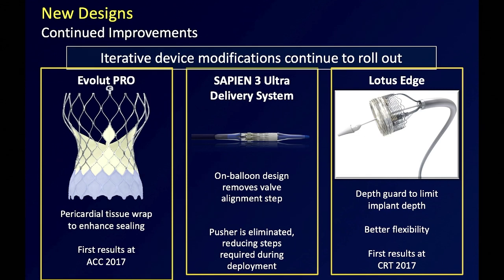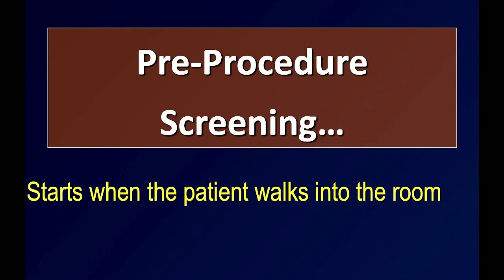The ones that we normally use in our lab are the balloon expandable valve approved in the United States, called the Sapien valve, which carries about 40% of market share in our hospital, and 60% is the self-expanding valve, which is the Evolut PRO+ FX now, Evolut FX.